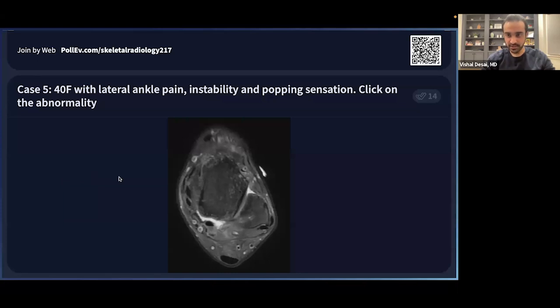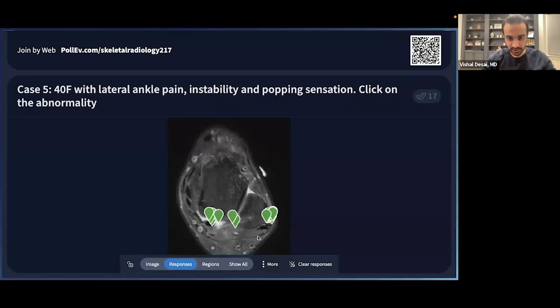Okay, another 10 seconds or so. All right, let's see how we did. Okay, looks like a good portion of people got it.